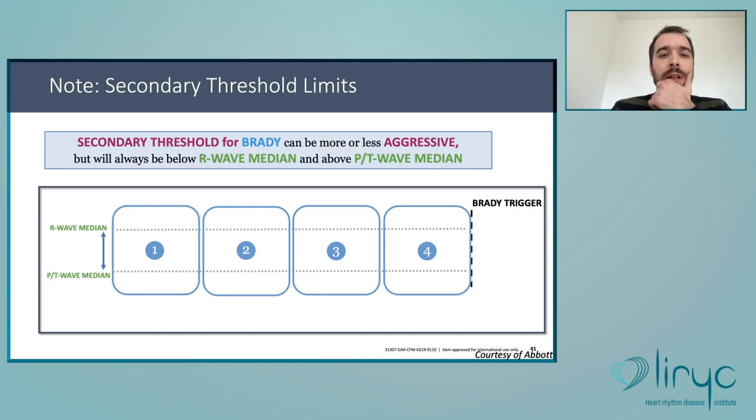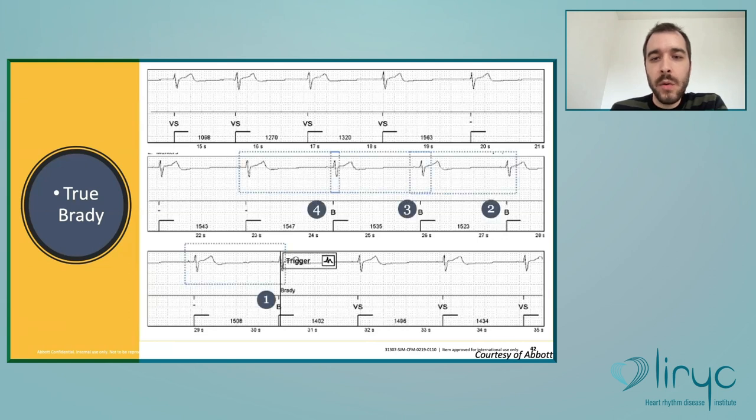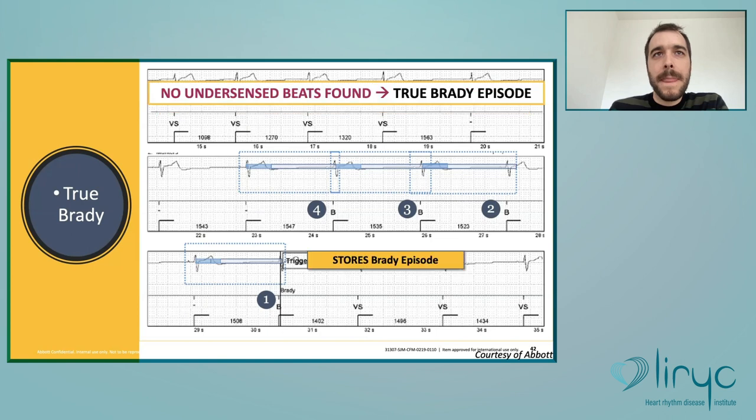This I've already explained. So we'll see here an example of a true Brady. So here are the windows with the secondary threshold. So the device does not find any undersense beat. So it will store the Brady episode.